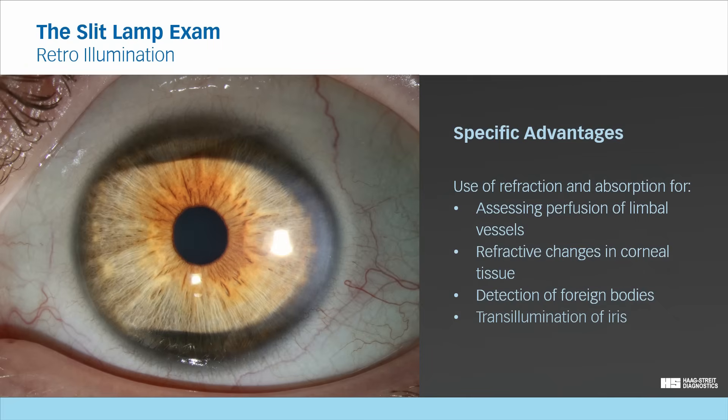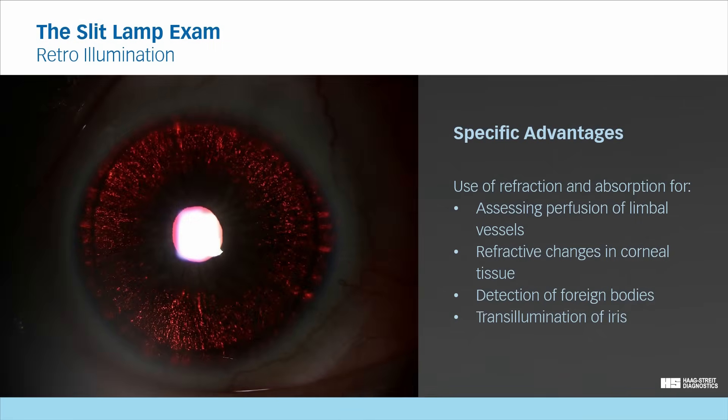In direct illumination, the iris appears to be normal. However, when the light is directed through the pupil and reflected from the retina to illuminate the iris from behind, it reveals pigmentary loss.